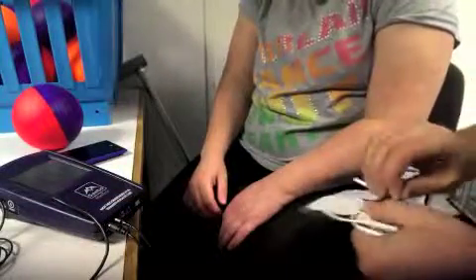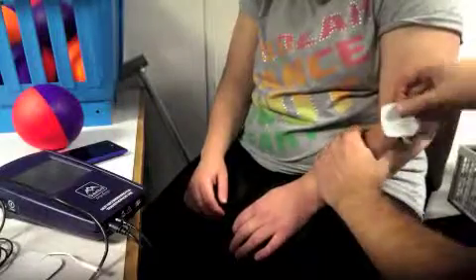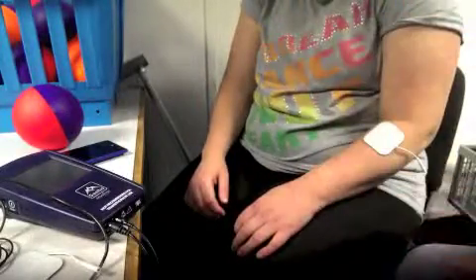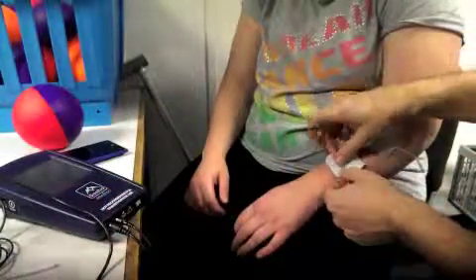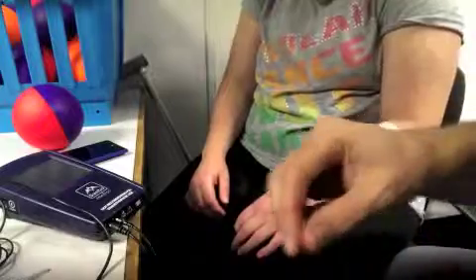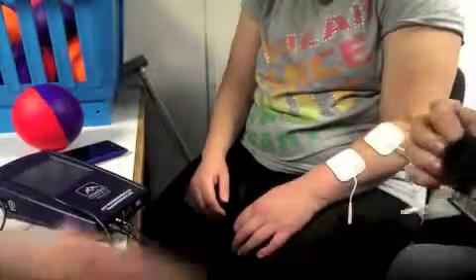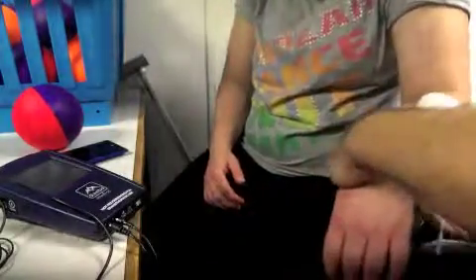Two pads for extensors — looking for the bulk. If the Saberflex is going to come on top, the leads are going to come out the side. Then we need three underneath. One is the earth for the trigger, so for the EMG to work as the trigger.